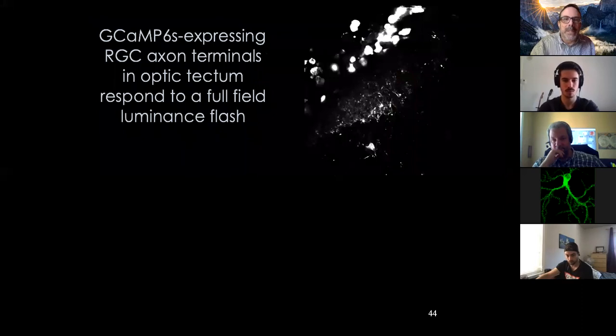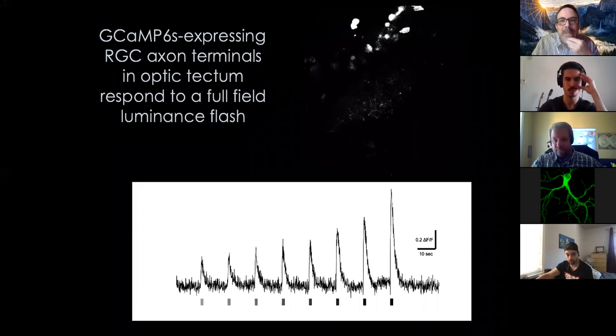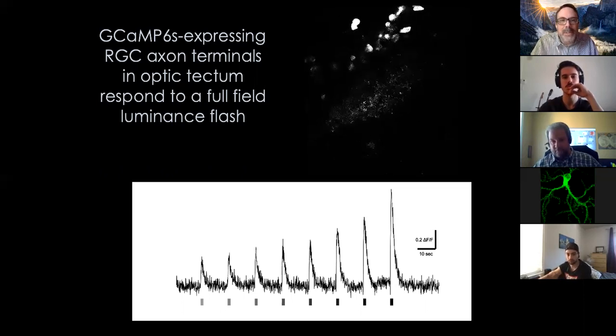So GCaMP injected like this gives you the retinal ganglion cell axons imaged on the contralateral side. That's the neuropil region. And we're just flashing lights of different intensity, different luminance, into the eye. It's kind of beautiful to be able to see all the retinal ganglion cells and pretty much no postsynaptic cells in this image. And so we can extract information about topographic maps and functional properties. This is where I would really like to be able to use that correlation-based structural imaging, if there's any way to get that to work, because there's the possibility of pulling out hundreds of individual retinal ganglion cells from an image like this.